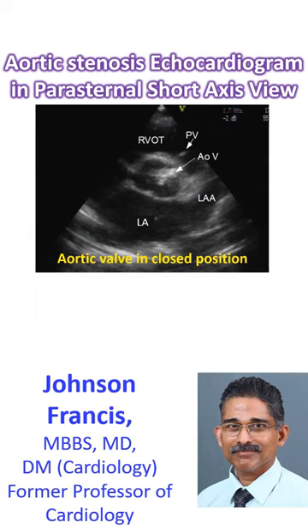Echocardiogram in parasternal short axis view showing aortic stenosis with a thickened aortic valve in closed position. One leaflet of the pulmonary valve in closed position, right ventricular outflow tract, left atrium, and left atrial appendage are other structures seen in this image.